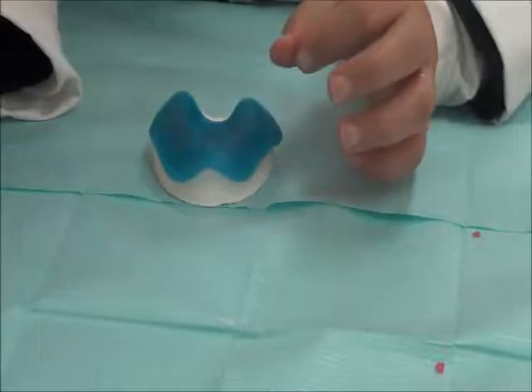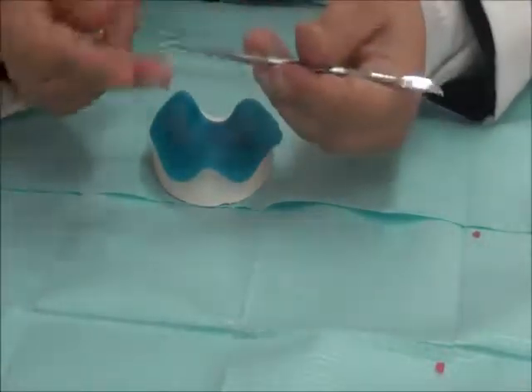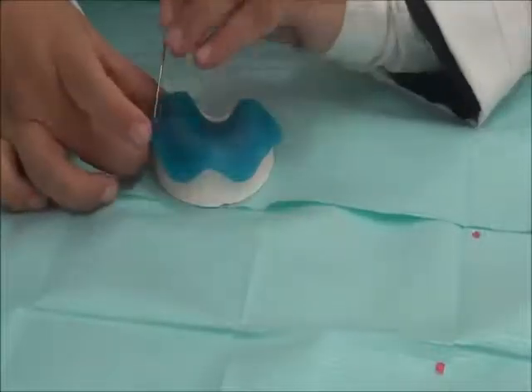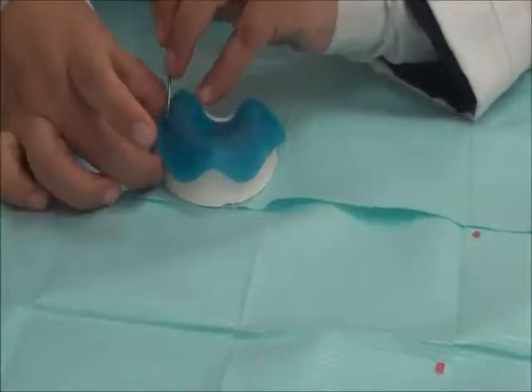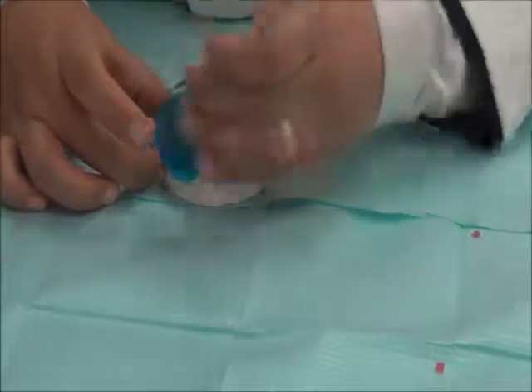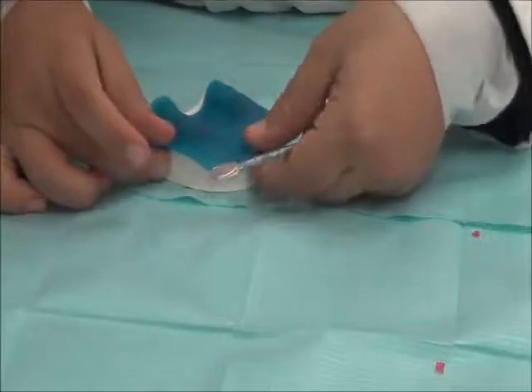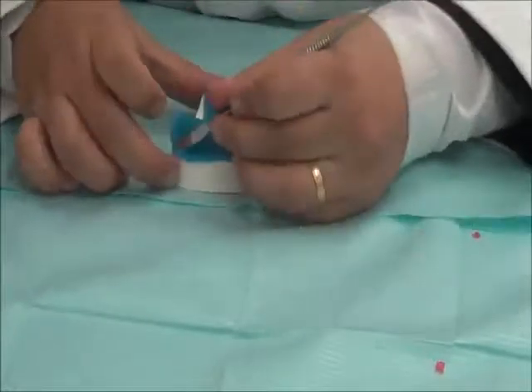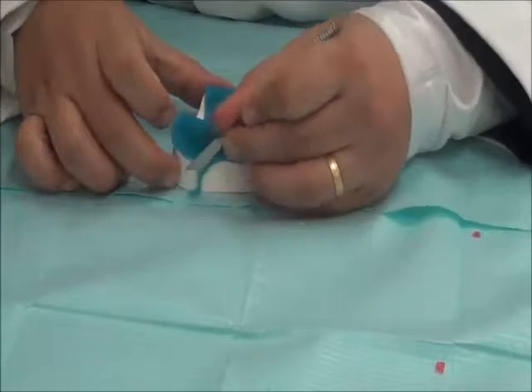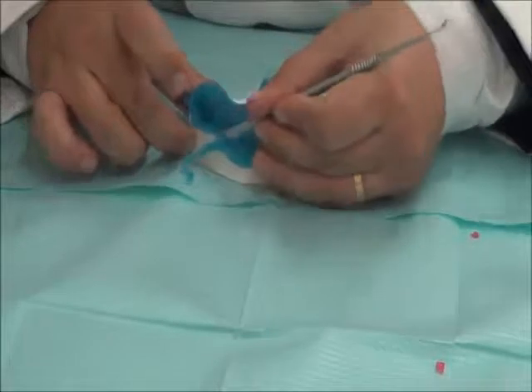To adapt inside the sulci, we could need the back of a lacquer carver or the back of a wax knife to press the material inside the sulcus and against the tissue in this area. If it becomes difficult, we could follow the following, where we simply remove the excess of the material from the outside of the land area, from the outside of the cast.